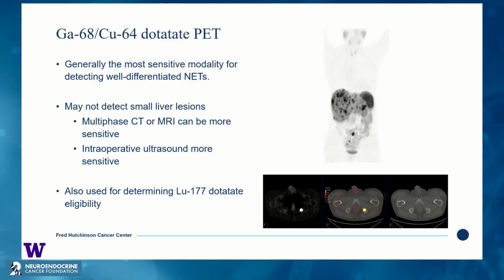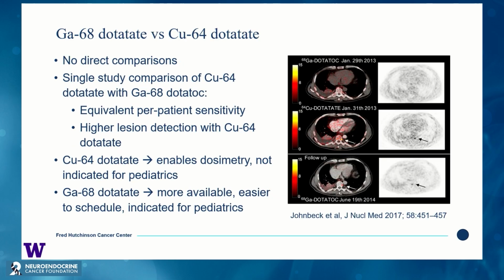Also, we use Dotatate PET for determining lutetium Dotatate or PRRT eligibility. And so we won't go into that in as much detail. We'll focus more on the diagnostic utilization.